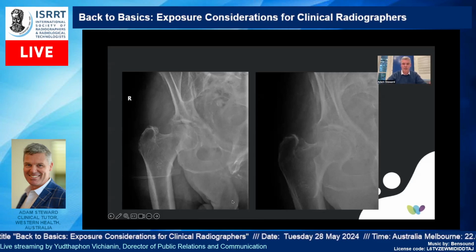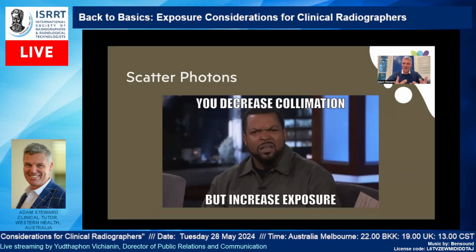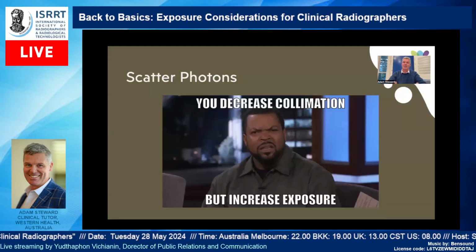So it's a very real thing. It really improves the image quality. But like I said, when you take the scattered photons away, you reduce the exposure to the detector, and you may need to actually increase. So if you want to look smart in front of your students, talk about that.